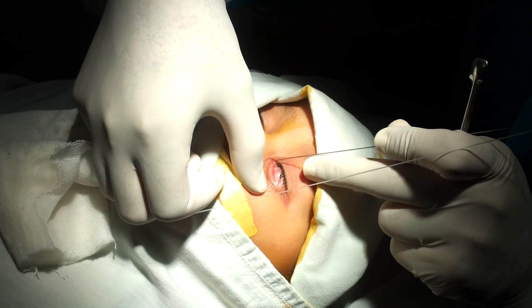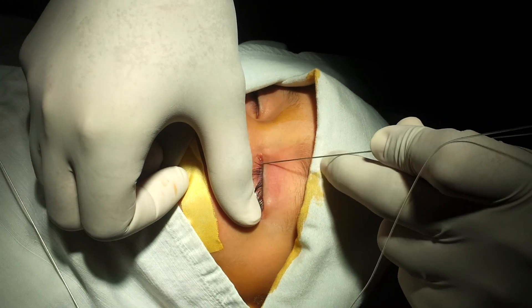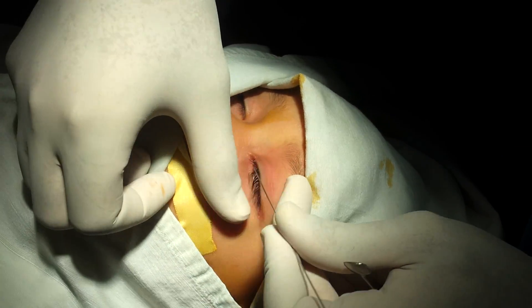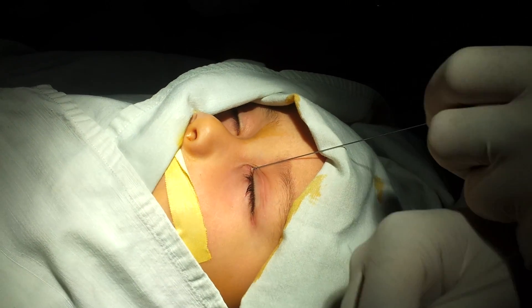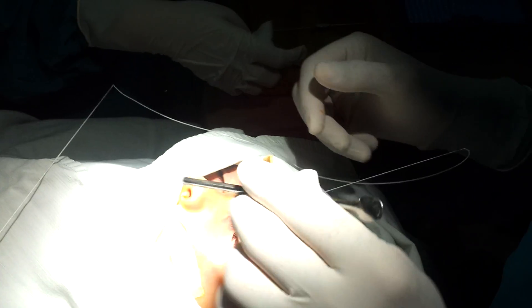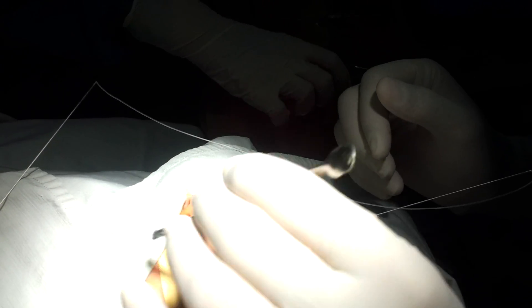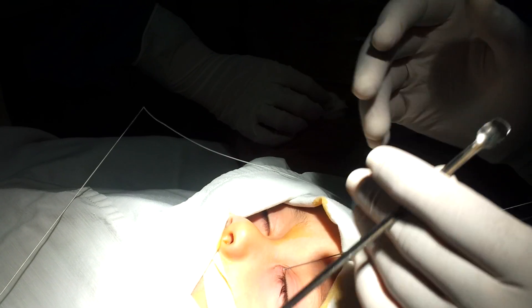We will start by the lower punctum first. Now, going to the nose, you want to go to the inferior turbinate. That means that you have to go lateral, because the turbinates are on the lateral side, and lower — downwards.